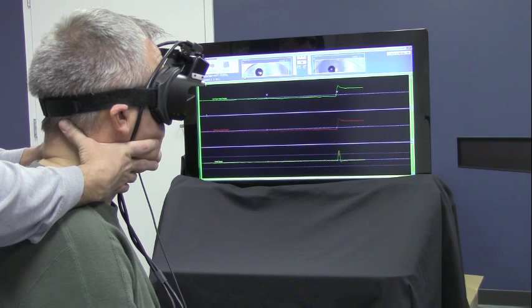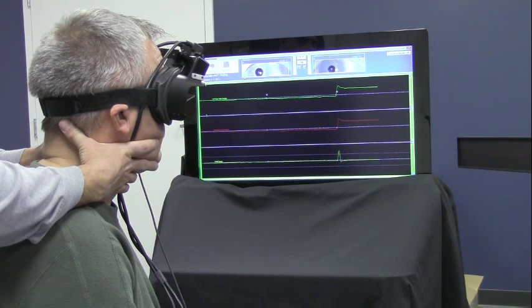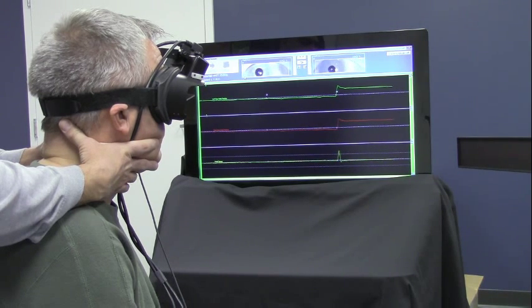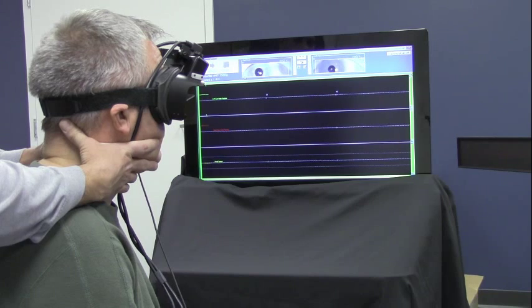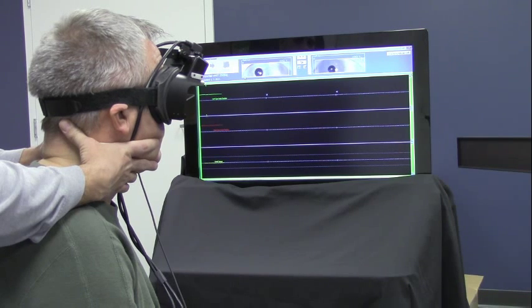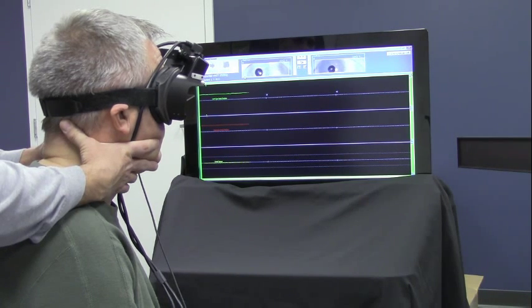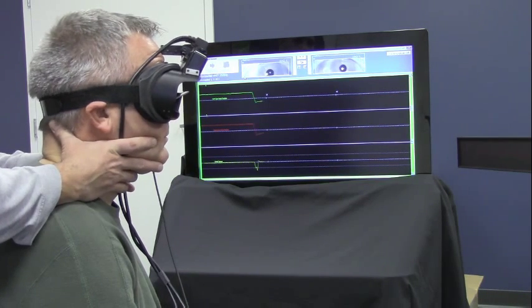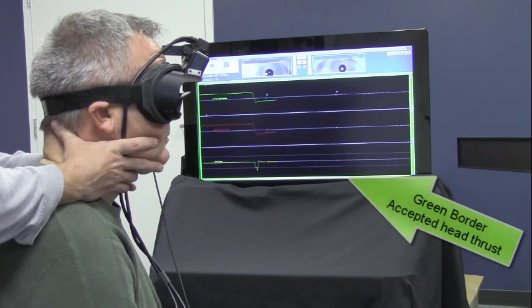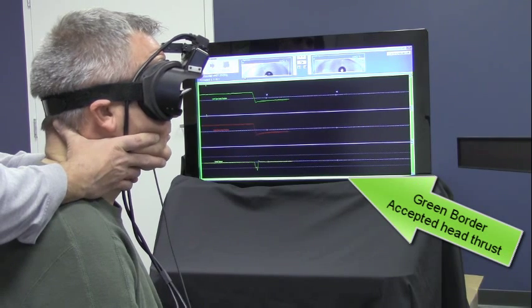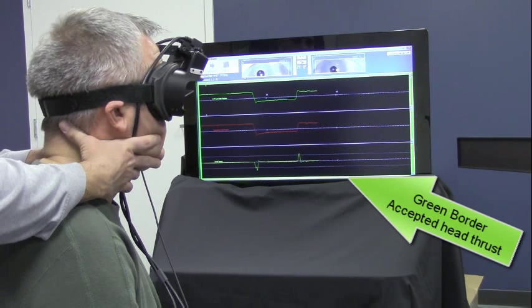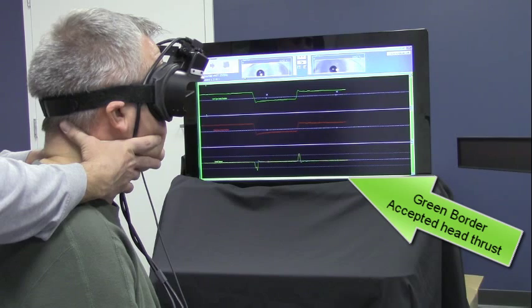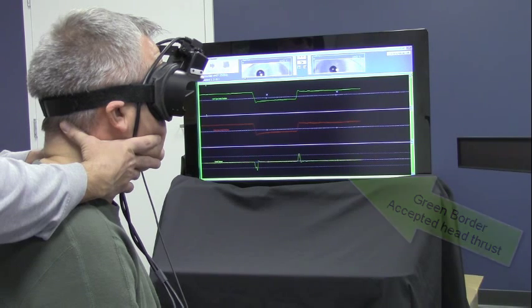There is audible and visual feedback from the computer. If the thrust is within acceptable velocity range, the background of the test screen will turn green, and you'll hear a ding sound from the computer.